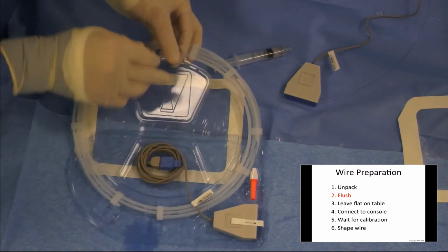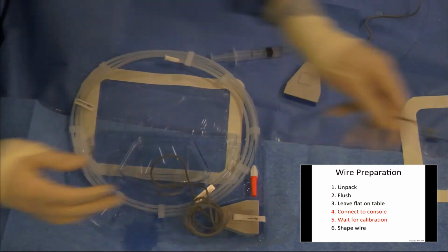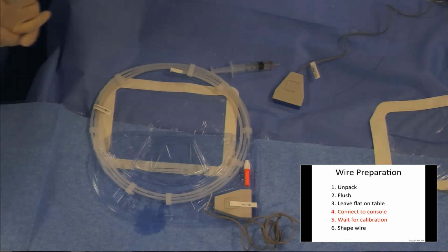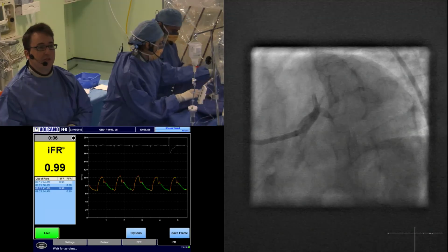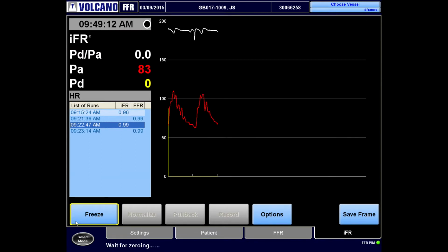So what I will do now is unplug this, open up the container, and pass that over to a colleague, and then he will plug that in for us now. So what I'm actually going to do is plug over, yep, that's great, plug that in. And if we look at the Volcano screen now, we'll see that that's plugged in. And if we go to the screen, you can see it says waiting for 0. A few seconds this takes. We'll flick across to live now. Waiting for 0.